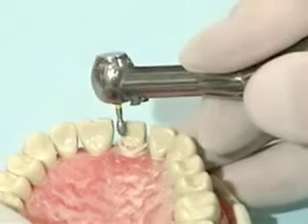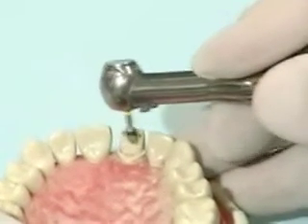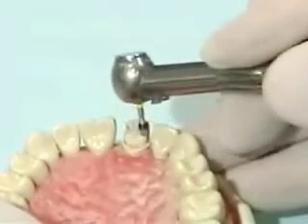Using the football shaped diamond, reduce the rest of the lingual surface by 2 millimeters to follow the contour of the tooth.